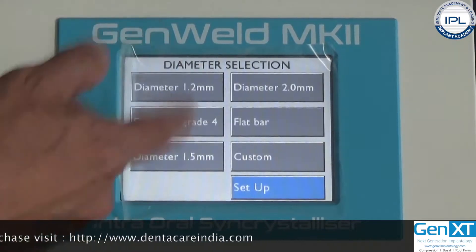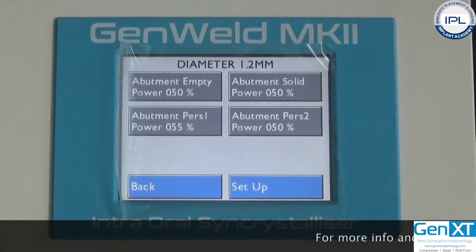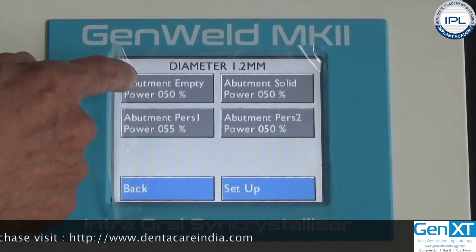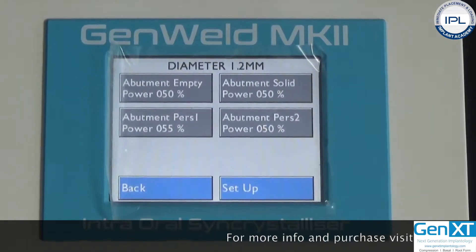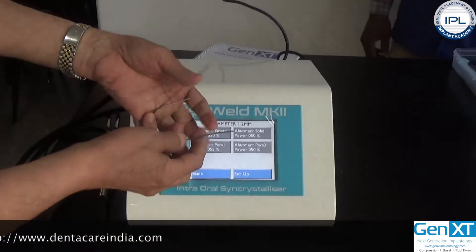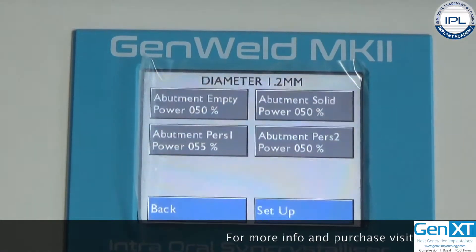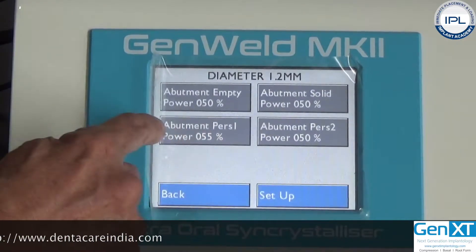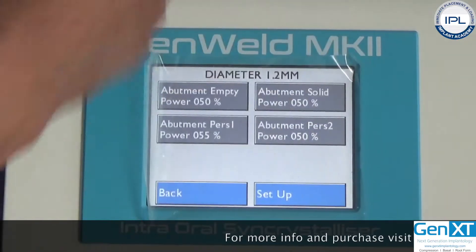For example, if I am going to weld a 1.2 millimeter bar, it then asks whether the abutment is empty — meaning, are you welding two hollow components or is it solid? In this case, I am going to weld a titanium bar, so I will choose solid. There are also two other compartments that allow you to pre-set or pre-calibrate the machine to different energy levels; all the details are in the catalogue.